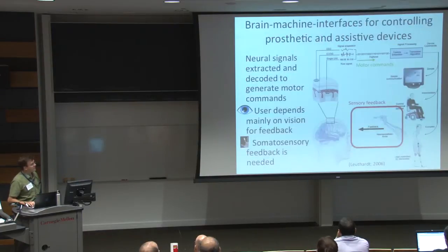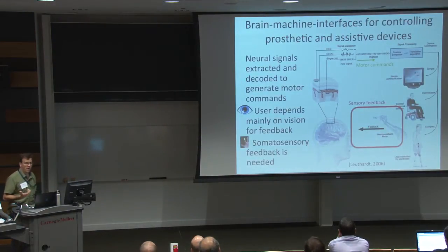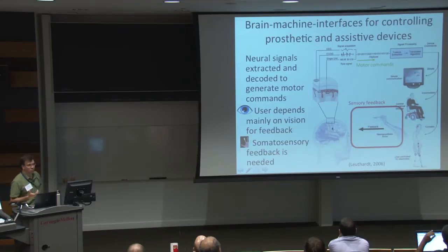Obviously the target audience is someone who has an amputation, and the goal is to restore that anthropomorphic upper extremity function to those individuals by channeling control signals, not through the normal ways, but through alternatives. And what Andy talked about this morning was using microelectrode interfaces implanted in primary motor cortex with the goal of extracting some sort of command signals from those motor areas of the brain, and then through some not so sophisticated math, it's really quite straightforward, actually.